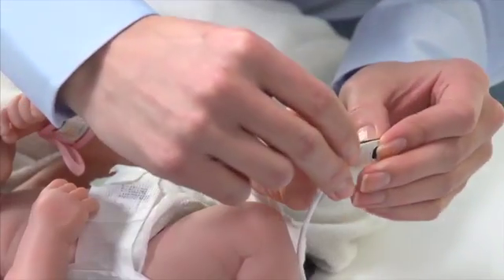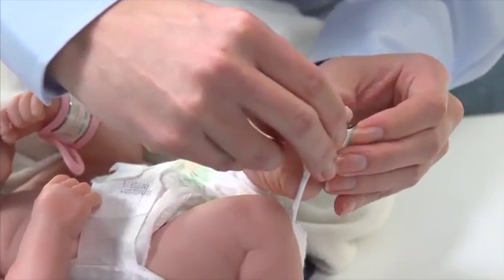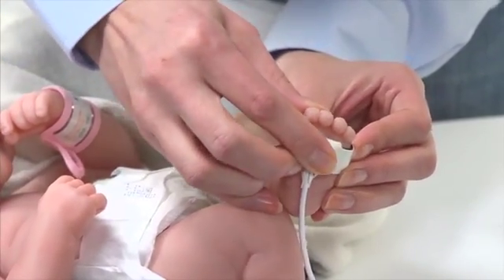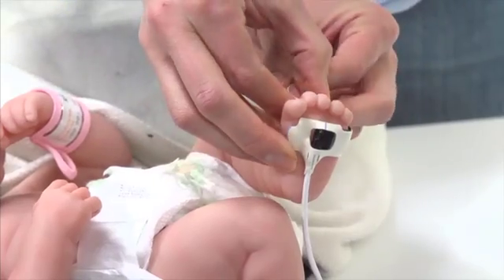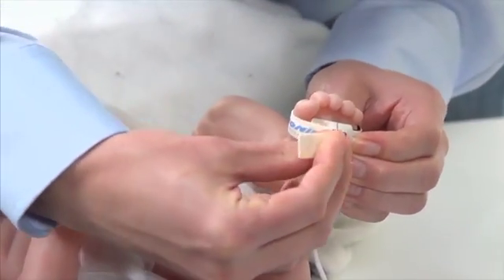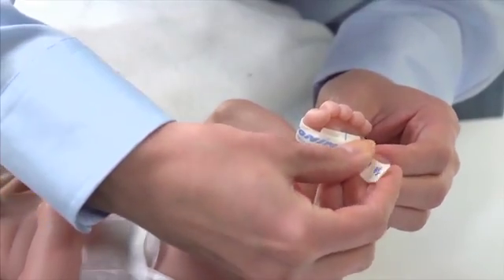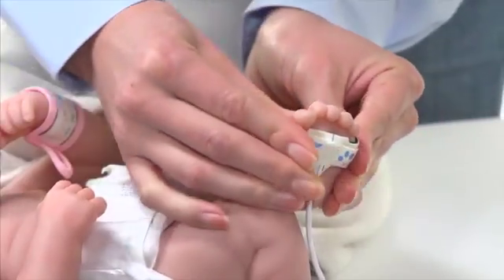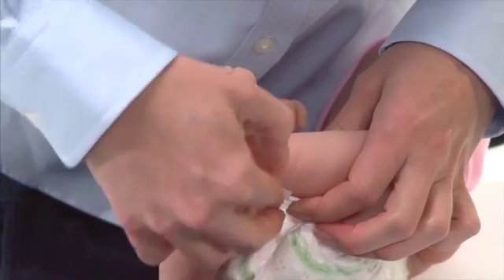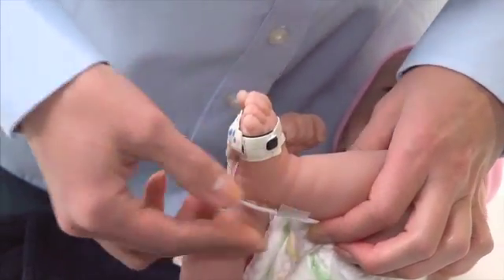For placement on the foot of a neonate 4 or less pounds in weight, place the adhesive and detector portion on the bottom center of the foot at the base of the toes, with the cable running back toward the heel. Now wrap the sensor on top of the foot, aligning the top portion with the sensor portion on the bottom of the foot. It's a good idea to gently secure the sensor cable independently from the sensor along the bottom of the foot or at the ankle, depending on the foot size.